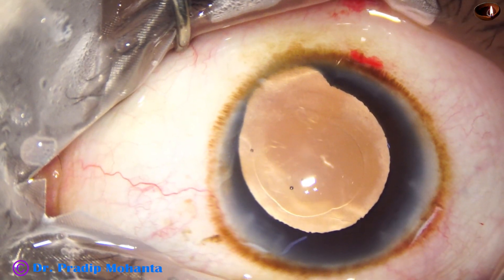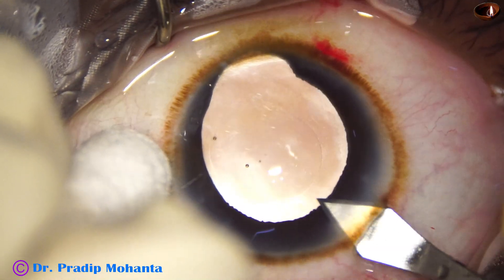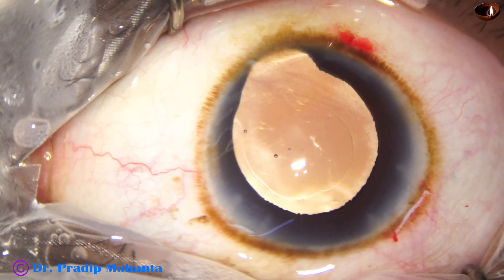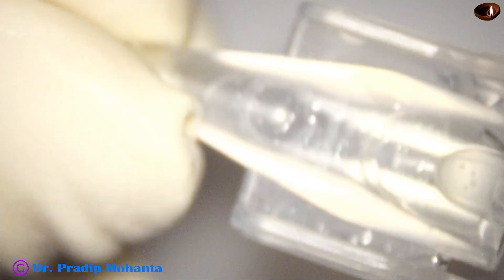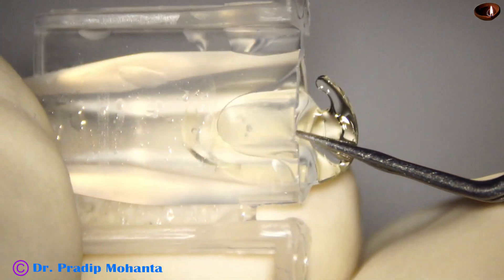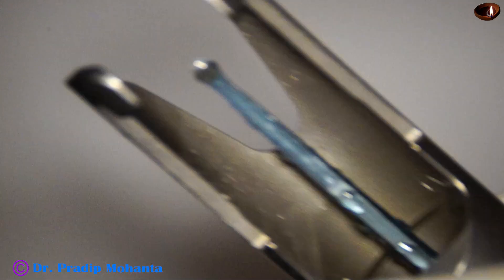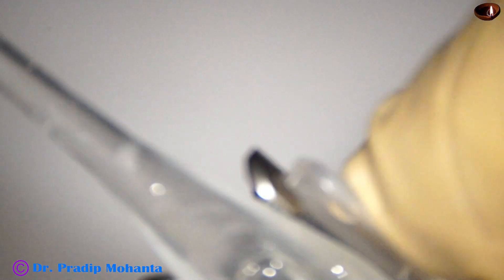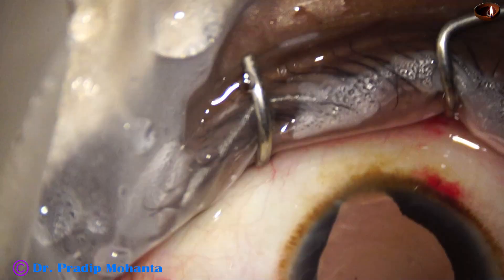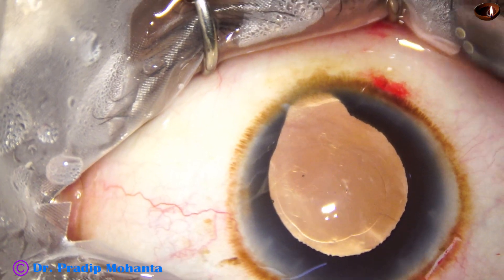Now I am going to enlarge the main wound slightly — by 0.1 mm. The main wound which was 2.8 mm is now 2.9 mm. Now the lens is loaded. This is a hydrophobic acrylic single-piece monofocal intraocular lens.